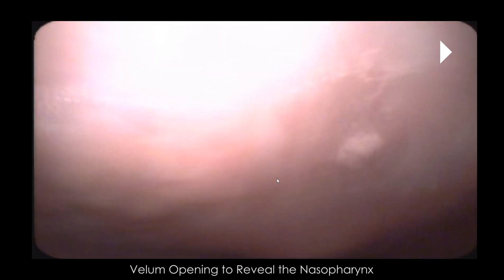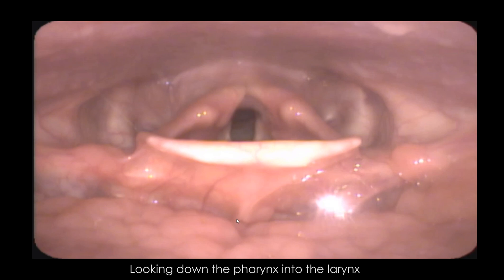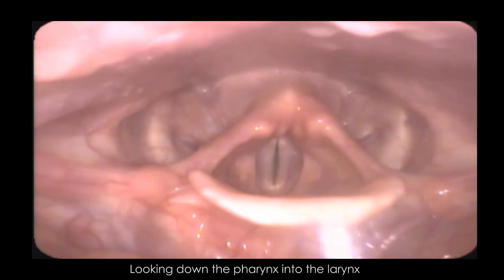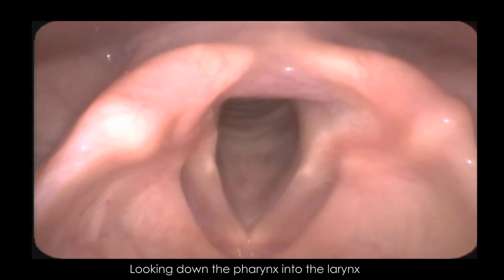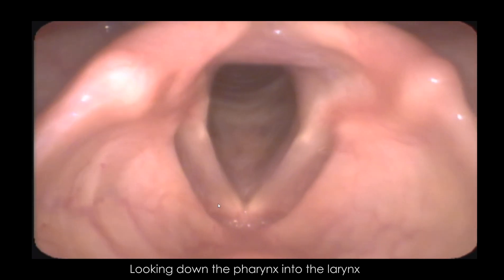We're just going to stick the camera to the back of my nose, and now we are in the pharynx. This structure here is the back of your tongue — this is the tongue root. This right here is the epiglottis. We can actually see the vocal folds down there; this is your trachea. Whenever you breathe there should be symmetric motion here — and everything looks good.